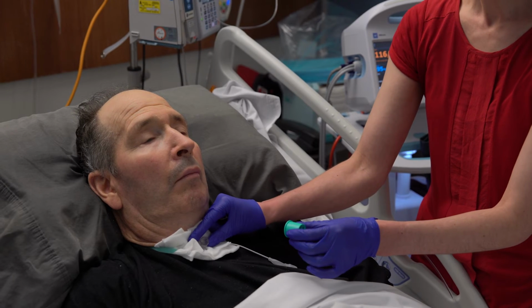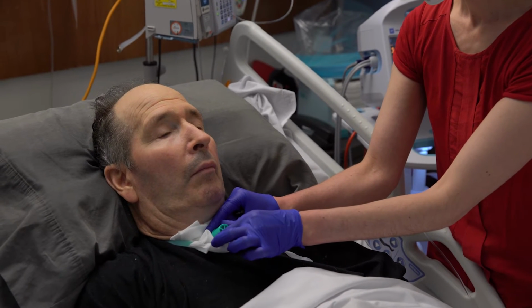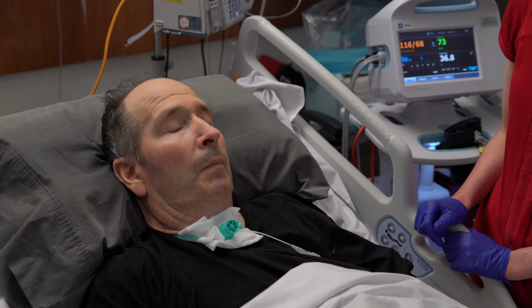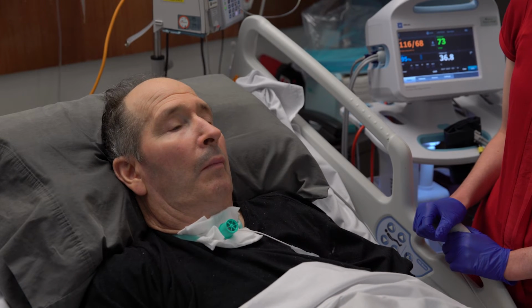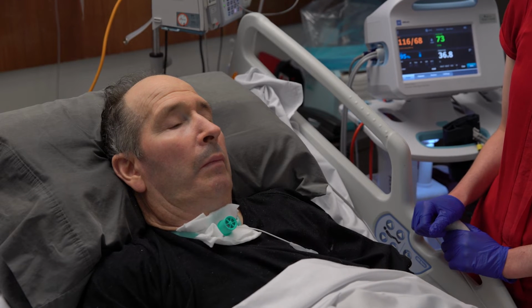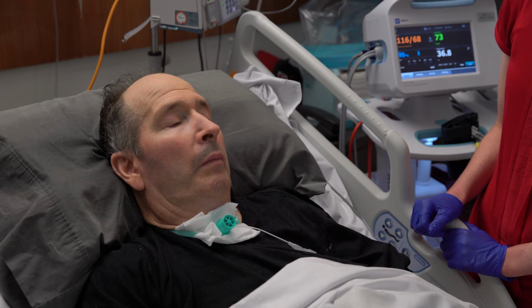Secure the tracheostomy tube with one hand, and with your dominant hand, place the PMV on the tracheostomy hub with a quarter clockwise turn. If the patient's voice sounds wet or gurgly, there may be secretions in the upper airway. Encourage the patient to cough those to the mouth. Clear the mouth with a Yankauer if required.